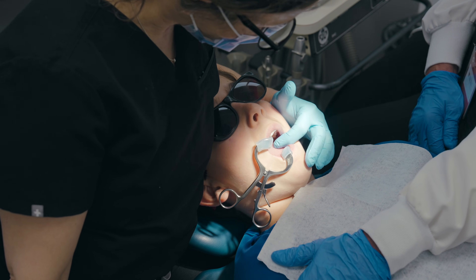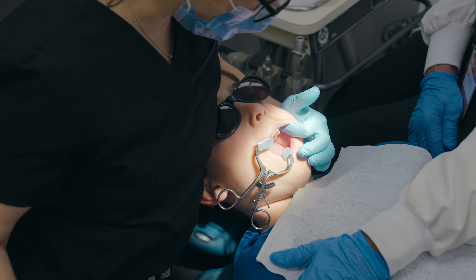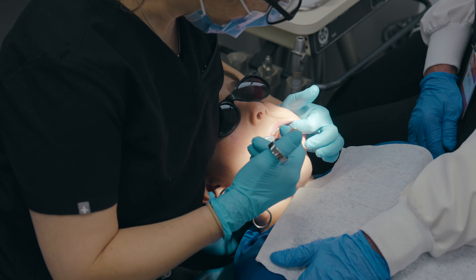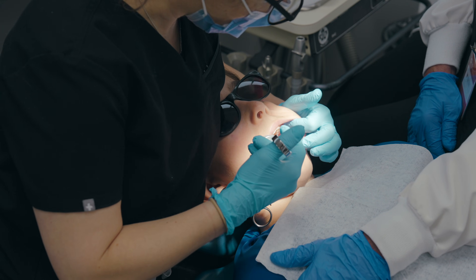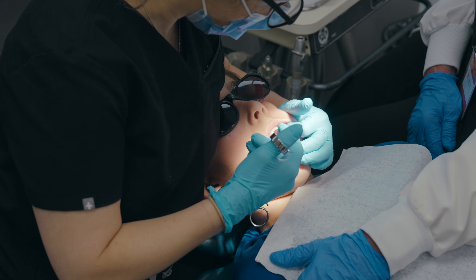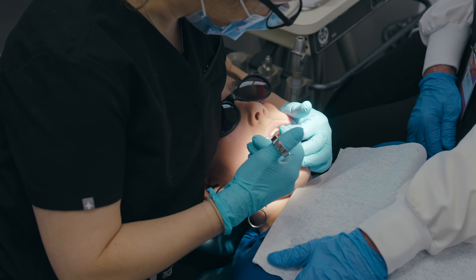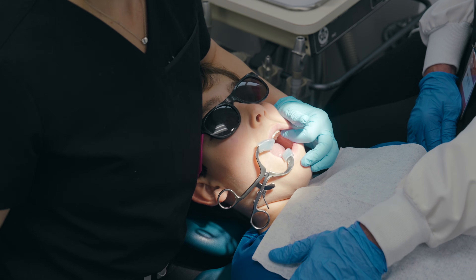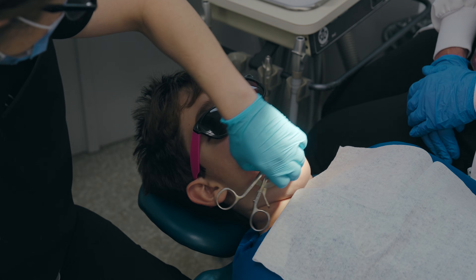Inferior alveolar nerve block. Once you have good head stabilization, ask the patient to raise their chin. Tissues are retracted and the syringe is carried to the mouth out of the patient's line of sight. It is often a good idea to manipulate the cheek while injecting, as this helps distract from the feeling of the injection.